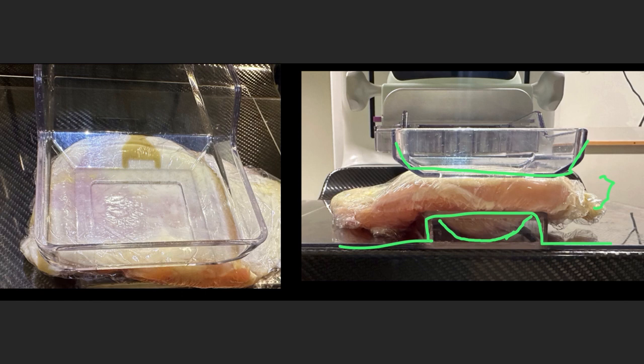Now, as you can imagine, the challenges with this might be that it may push away from you when you're putting that needle in, if you're not careful. And it may make subtle abnormalities not so easy to see. However, it's a very thin breast, so usually you can see subtle abnormalities pretty well. But just to be aware of that. We have, on occasions, put a piece of Tegaderm on top of this paddle so that there is less bulging through the hole, but usually that's not needed.